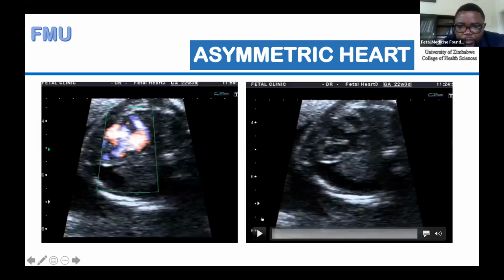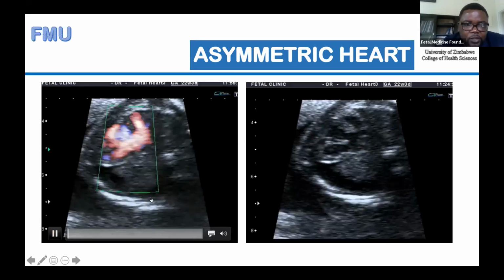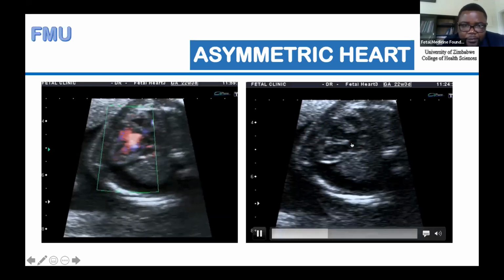Let's go to another four-chamber view. Probably this video will play this time around. Will it? I wanted to show you this video. But anyway, this video is the same one as this one.